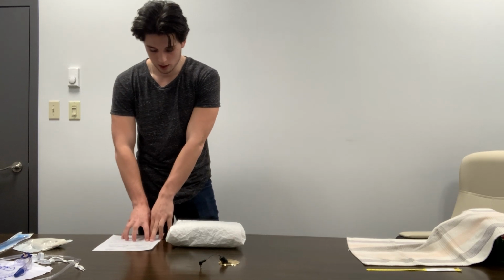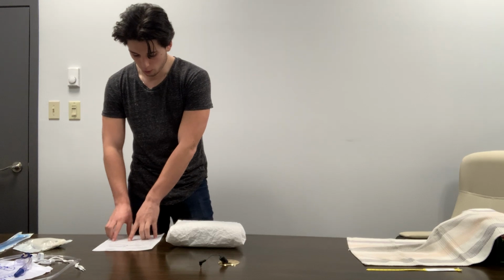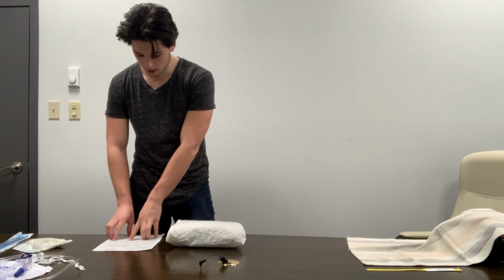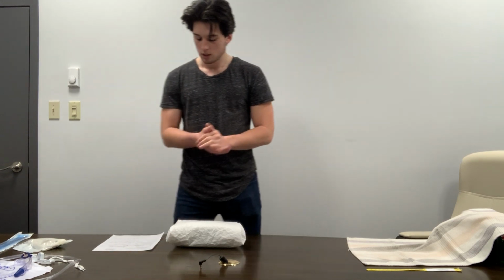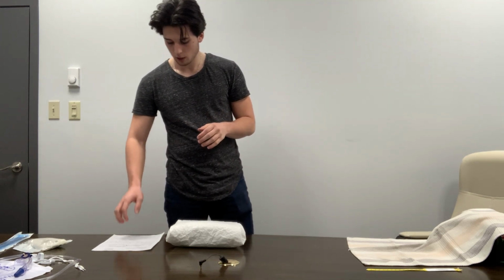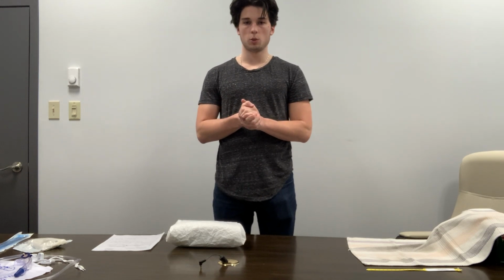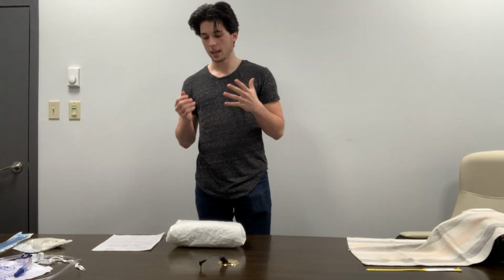So for today, February 7th, 2021, at 07:36, we have an order to insert Foley catheter now to monitor fluid balances, intakes, and outputs closely. So we can see that it has been transcribed or signed and as well as reviewed. So the physician's orders are good, and once we have reviewed those, we will gather everything we need.